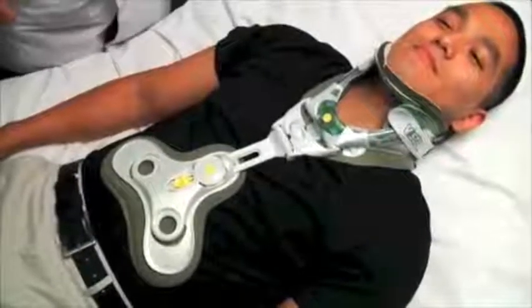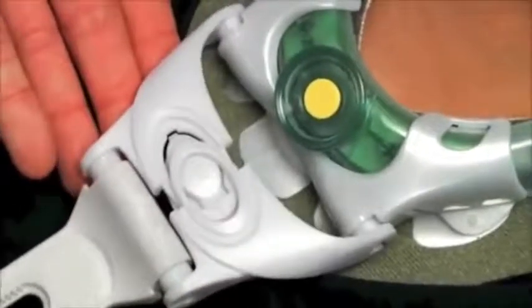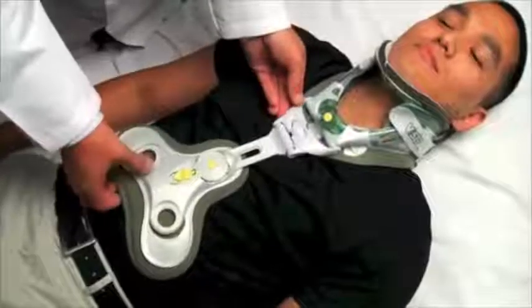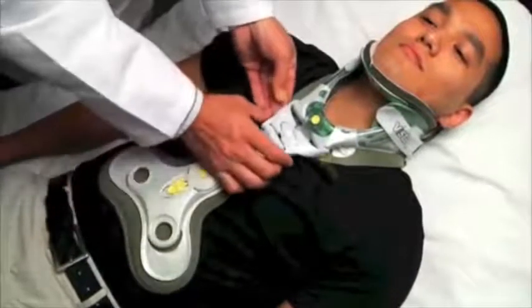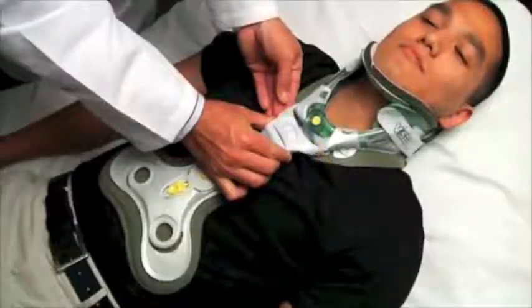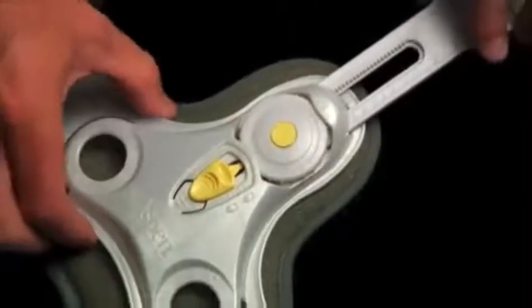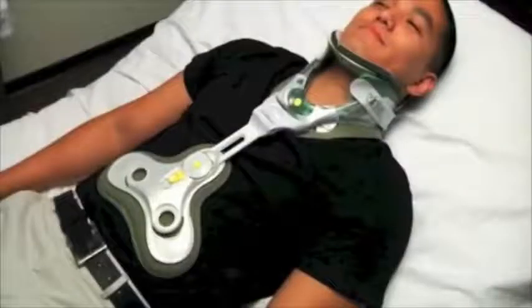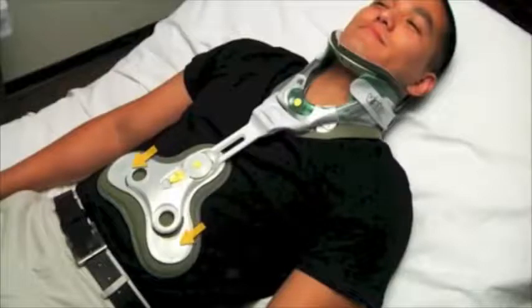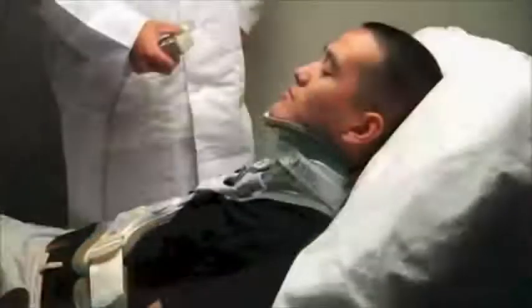Begin with the adjustment points unlocked. If necessary, push the wide angle adjustment button and pull to separate, disengaging the yoke. Determine the desired custom angle by letting the piece fall into its natural position, then squeeze the yoke back together to secure the custom angle. Push down the secondary lock on the height adjustment dial and slide the primary yellow lock down to enable vertical height adjustment. Turn the dial until the vest sits at the desired position. When fitting a supine patient, the vest should be positioned as low as possible to allow a large range of adjustment as the patient moves from supine to ambulatory.